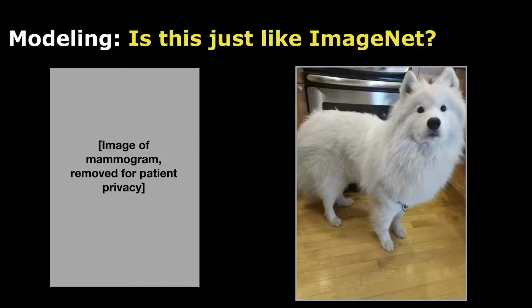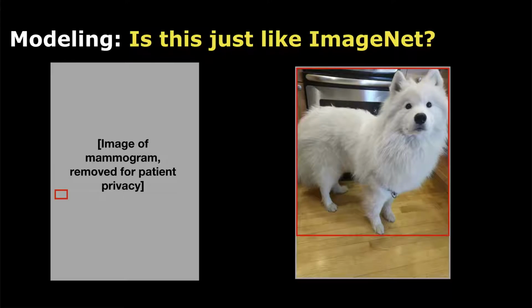Okay, so can anyone tell me, now that you had some training with Connie, if this mammogram indicates cancer? Well, it does, and this is unfair for a couple of reasons. But let's go into why this is hard. It's unfair in part because you don't have the training, but it's actually a much harder signal to learn. So first, let's delve into it.